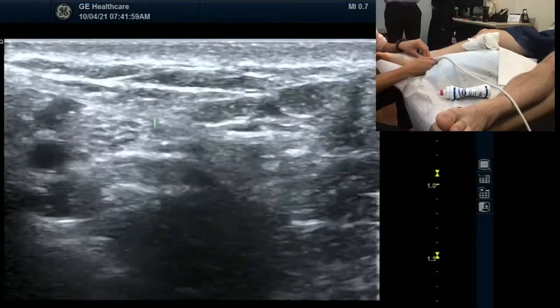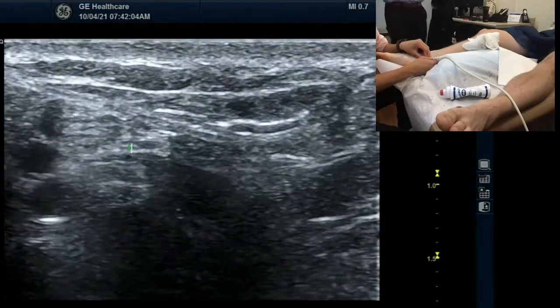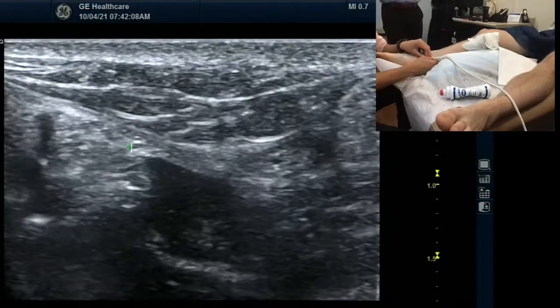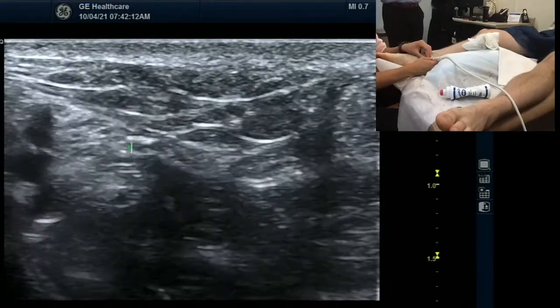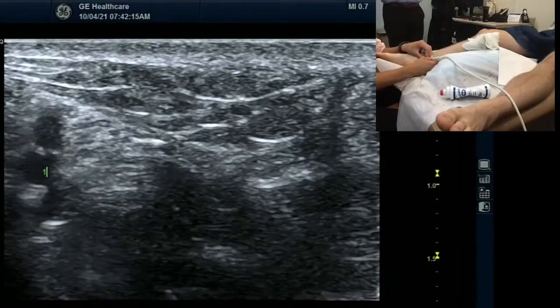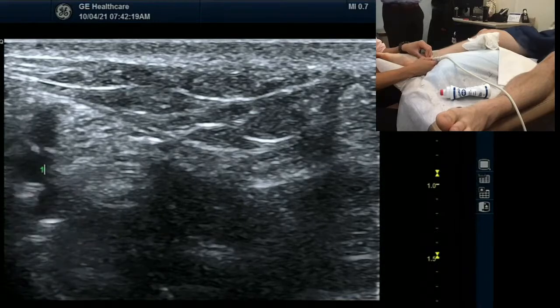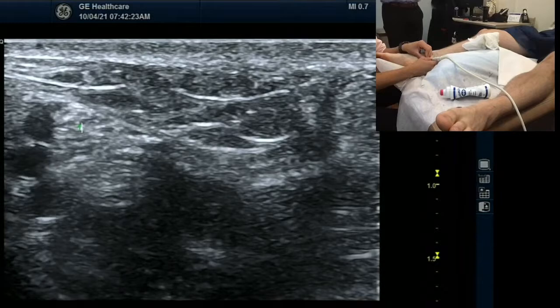Let's go back to home base. Look at the main tibial nerve and then follow each branch. So this is the big tibial nerve. Tibial nerve. Stay there. That's much better. I cannot see from — oh, that looks great. This is home base. Where is the artery? Is this the artery? Yes. Artery vein. Artery. Guys, this is the artery. This is the vein. This is the tibial nerve.